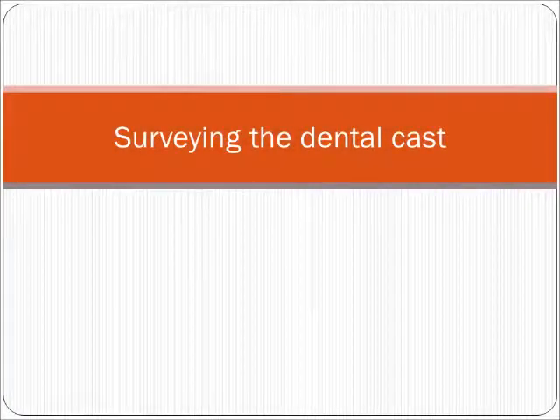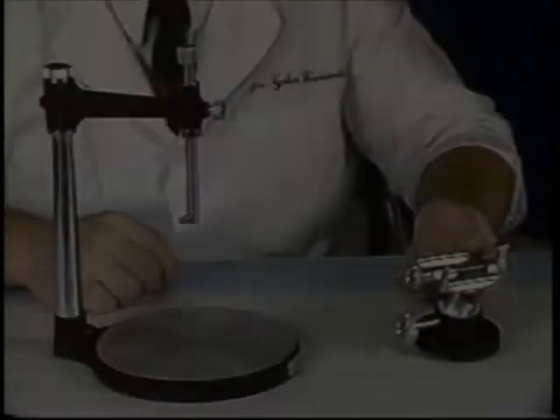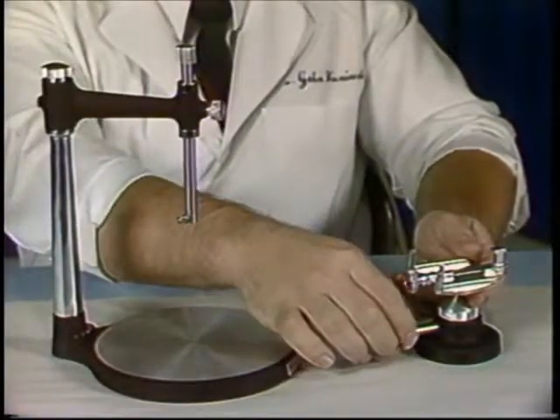Surveying the dental cast is an important preliminary procedure used in the diagnosis and treatment planning of the removable partial denture. In this video, we will demonstrate and discuss the armamentarium, rationale, and procedure for surveying. There are several components involved in surveying.